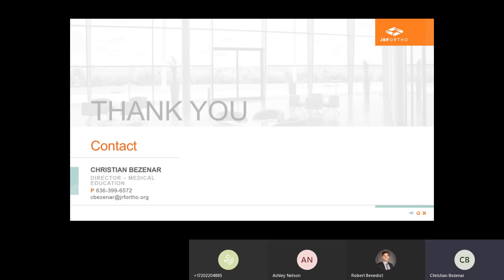Yeah, it's a great question. Historically, the depth of the plugs tended to be a little bit more, maybe 10 millimeters plus, 12 to 15 millimeters. That's a lot of bone that ultimately needs to incorporate and heal, and so you may be delaying that healing pathway by putting too much bone in place. On the other end of the spectrum, there was a recent paper from Andreas Gomoll speaking to the fact that too thin of a plug, potentially you lose a little bit of that interference fit, and there may be some micromotion that can lead to cystic formation on the underneath side of the plug. So the consensus from this group of experts and thought leaders is that an overall depth of 6 to 10 millimeters eliminates an overabundance of donor bone that needs to incorporate, but still allows mechanical stability at time zero to allow the patient to go off and heal.